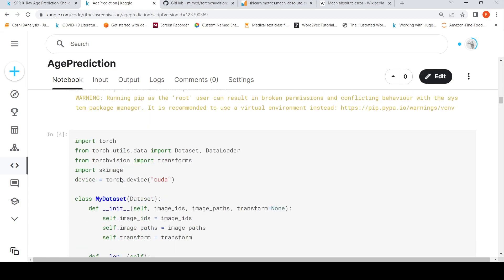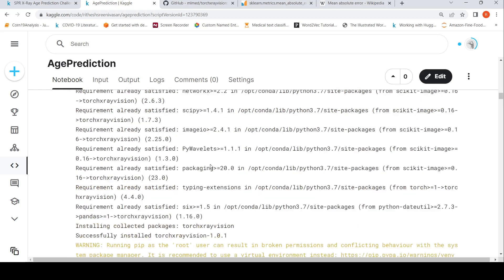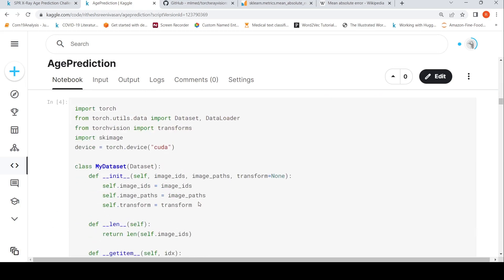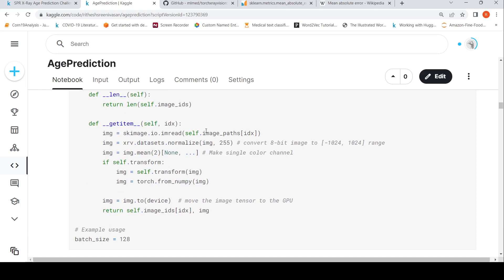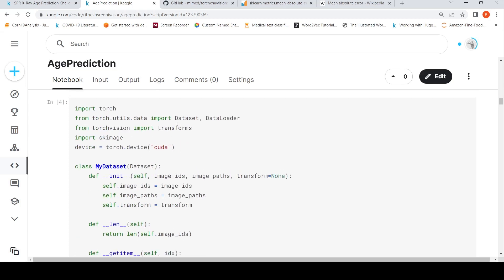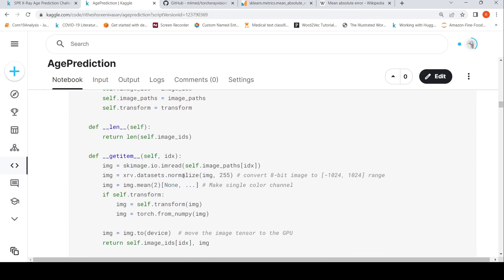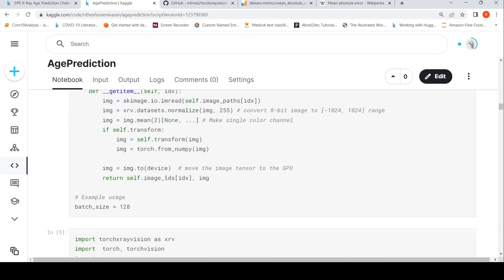I'll be using TorchXRayVision pre-trained models. I create a dataset class that accepts a list of image IDs and image paths. The get_item method reads each image, normalizes it from an 8-bit image to the minus 1024 to 1024 range, makes it a single color channel, and applies transformations. The class extends PyTorch's torch.utils.data.Dataset, and the batch size is 128.